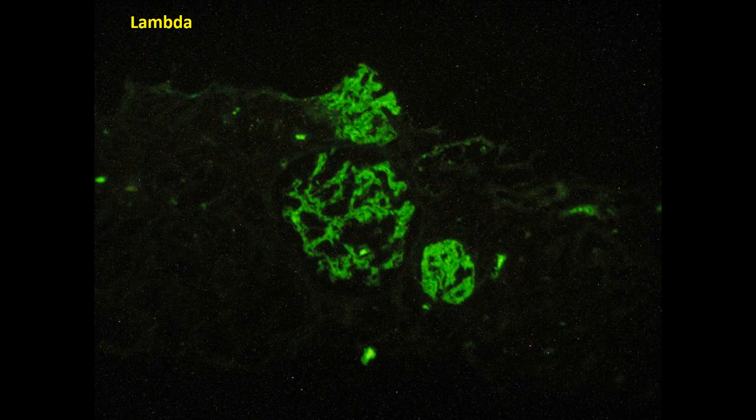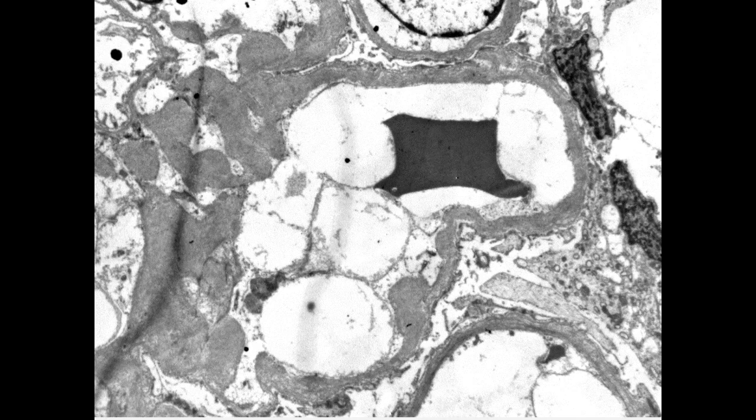And in this case, we didn't have tissue initially submitted for electron microscopy. So we went back and reprocessed for electron microscopy the tissue fixed in formalin and embedded in paraffin. And this is what we found.